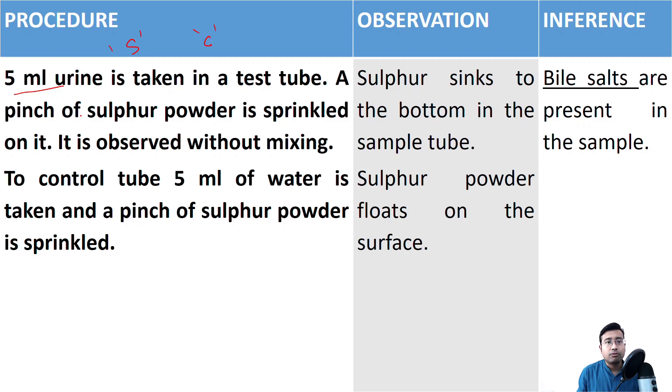And on top of that, we need to sprinkle a very small amount of sulphur powder, just like that with the first spatula. Similarly, in the control tube, we need to take same volume that is five milliliter of distilled water. And on top of that, we need to sprinkle very small pinch of sulphur powder. And that's it. This is the procedure.